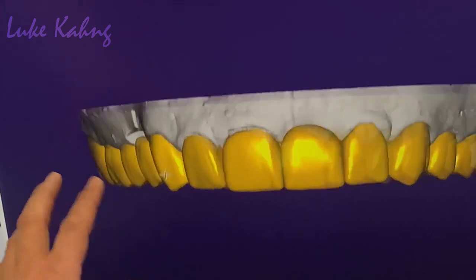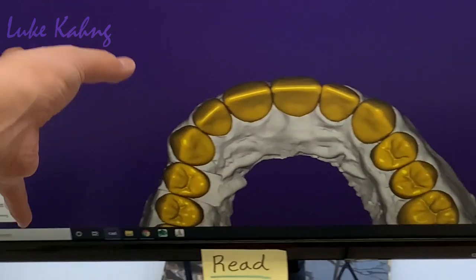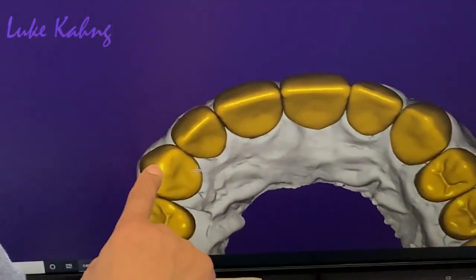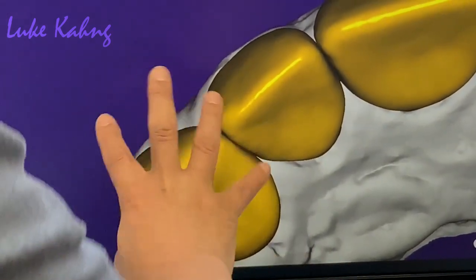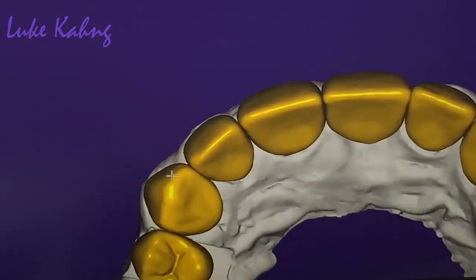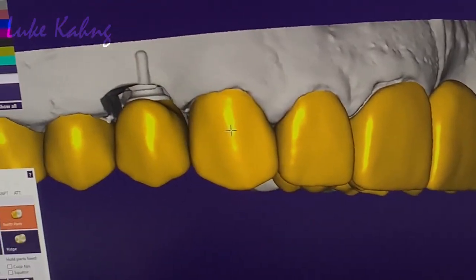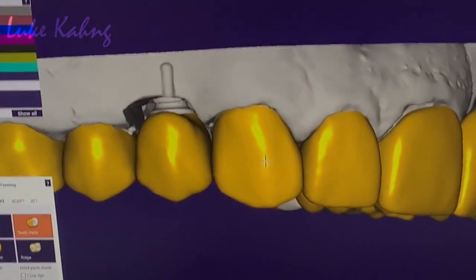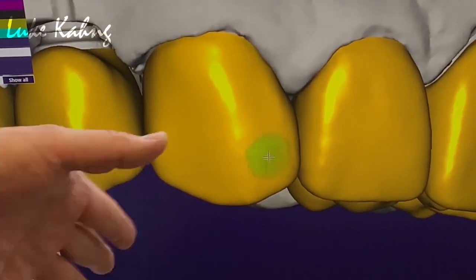So this, the occlusion view. But these teeth move like this. This lower angle will be here. So it's this line angle over there. So what I say is a long axis. Long axis will be here. More movement, yes. And then slightly add here, in between, concave.